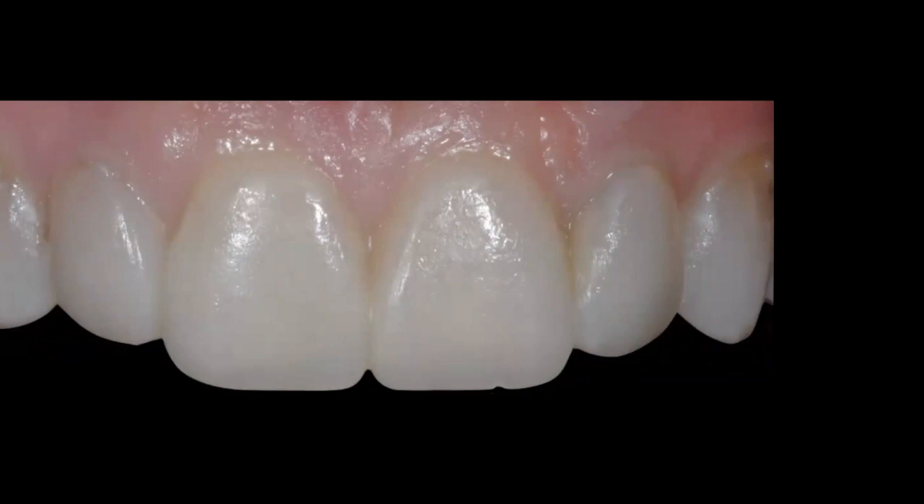This is my bonded functional aesthetic prototype — created with flowable composite injected into the internal surface of the clear PVS and seated directly in the patient's mouth. Teeth 7, 8, 9, and 10 are now one solid structure of flowable composite. You can see very little flash immediately after light-curing, with a lot of detail between each tooth and well-defined facial embrasures. And I do this without any anesthetic.